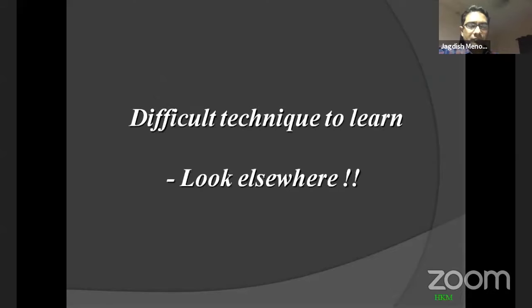It is a difficult technique to learn, because we look elsewhere, towards the monitor, and then we operate in the joint. So it is a difficult technique to learn for normal orthopedic surgeons.